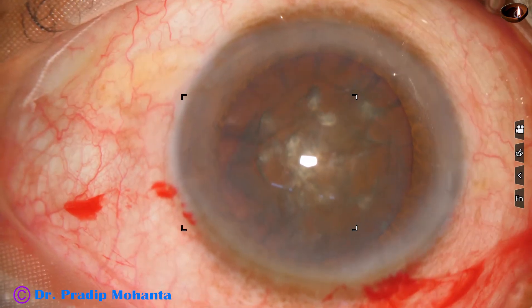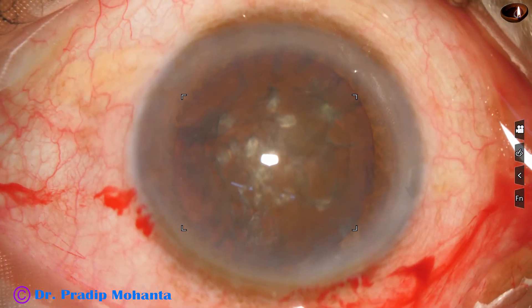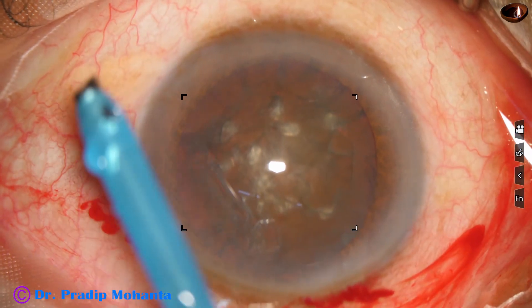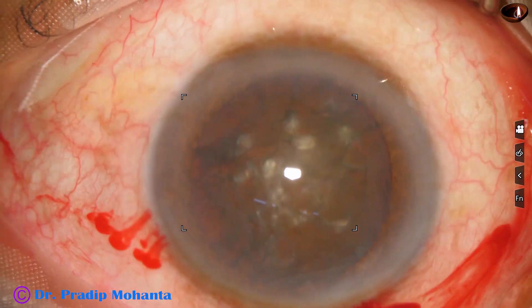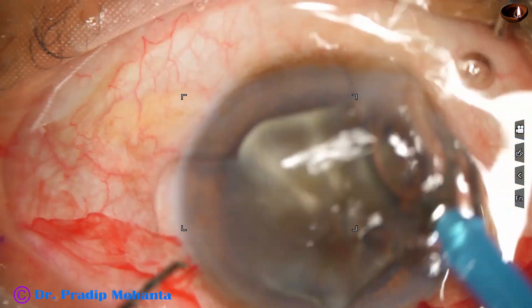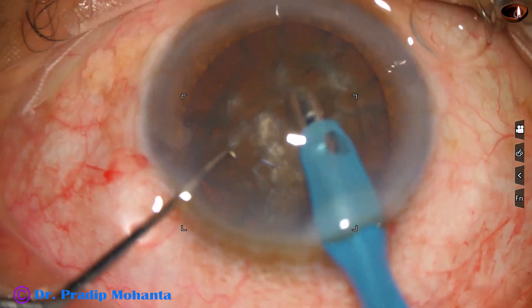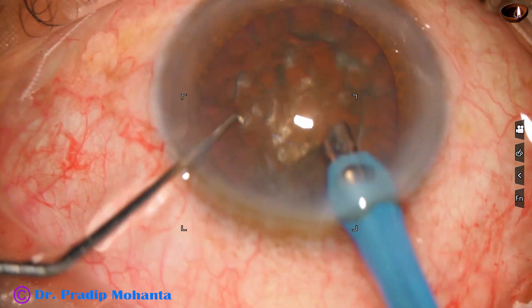And now I take 2 hooks and rotate the nucleus. I am going to employ my submarine chop technique to divide this nucleus into 2 hemi-nuclei. In submarine chop we expose the tip a little more and bury the tip just in front of the main incision into the substance of the nucleus, then go through the nucleus towards the opposite equator. Some superficial cortical lens matter is removed to improve visibility.